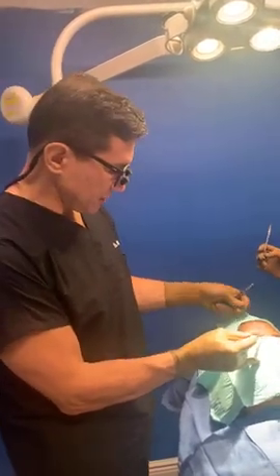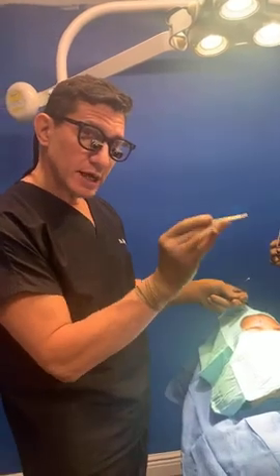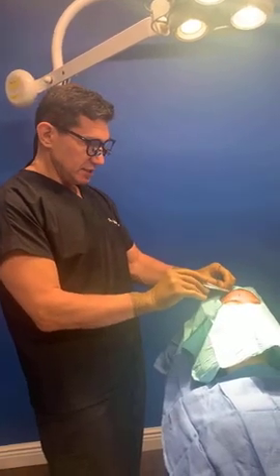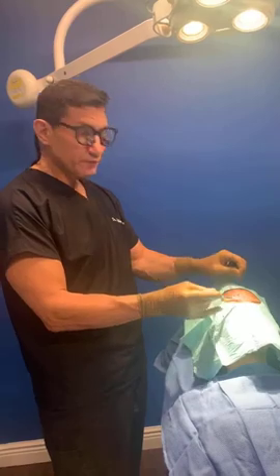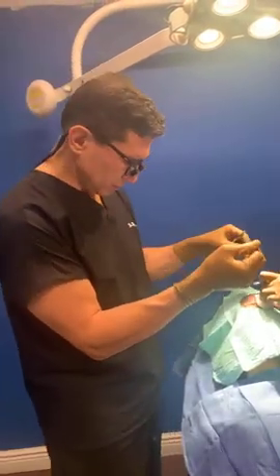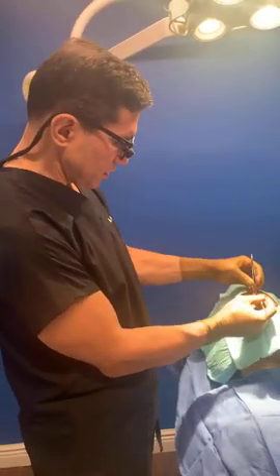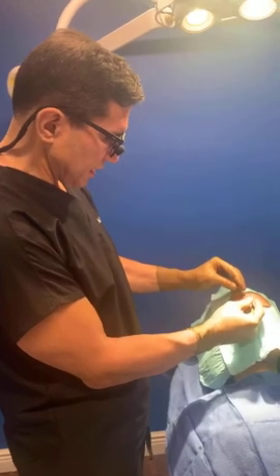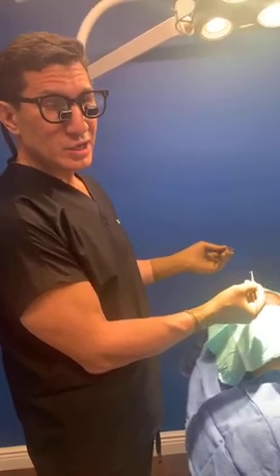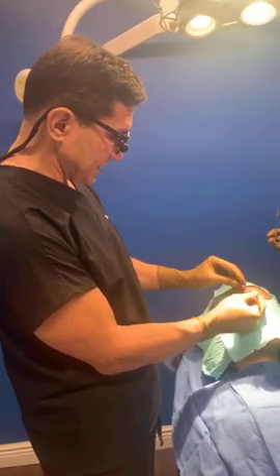With serial excision, what I'm basically doing is I cut out the inside of the scar, leaving around maybe 50% of the scar still there, but I don't extend the excision beyond the confines of what the original scar was. And then we let it heal. How long was it? I think just maybe 2 months. Was it 2 months or so? I think so. And then we let it heal, and now the scar is still 1 inch long, right? But now it's only like a quarter of an inch wide. So she's coming in today, and I'm doing the second stage.